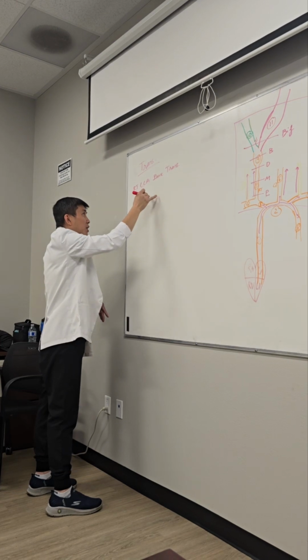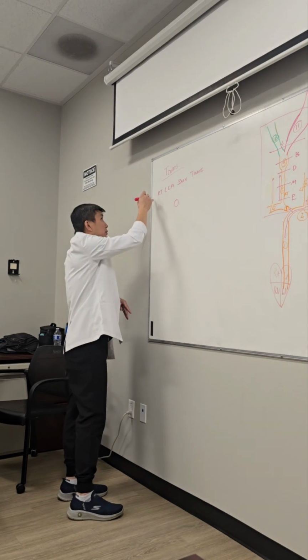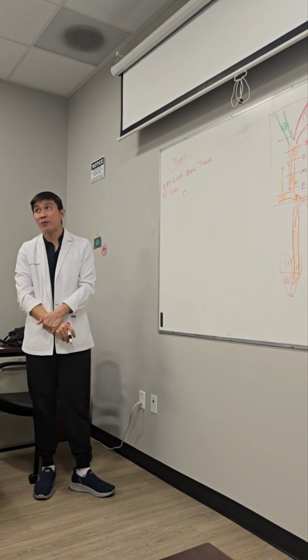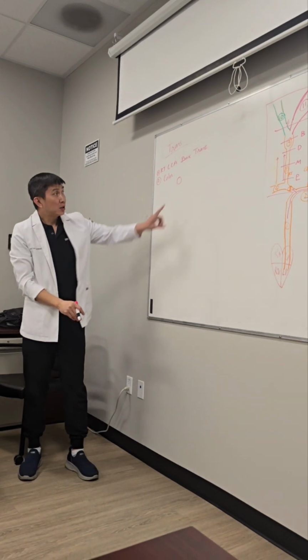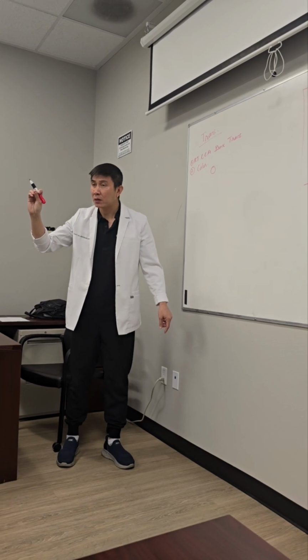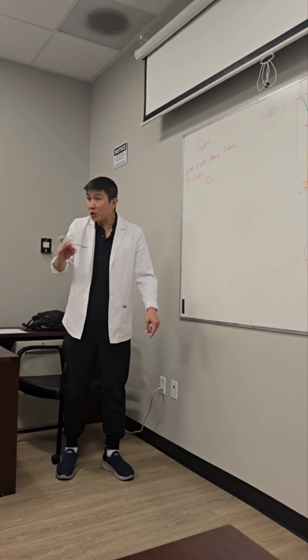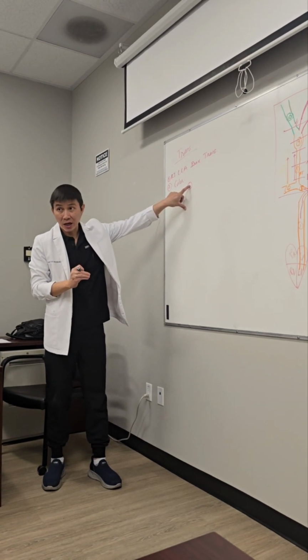And then you're going to scan in B mode with a circle. And then you hit color. This is the requirement for B mode and color for the vessel when you scan in vascular. In B mode, the lumen of the vessel has to be completely anechoic. So you have to use all your technique, all your skill to adjust the vessel lumen to be anechoic.